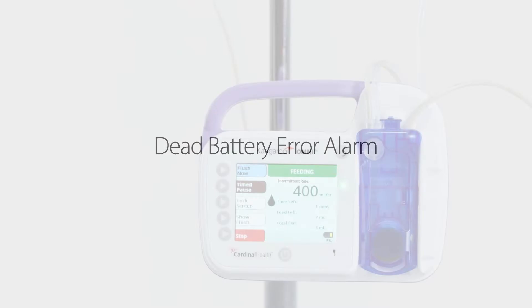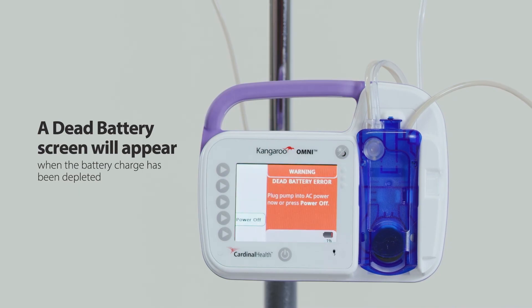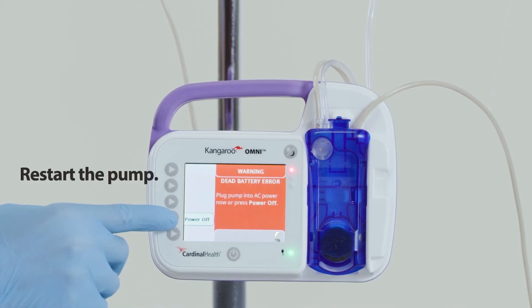Dead battery error alarm: a dead battery screen will appear when the battery charge has been depleted. When this warning occurs, the Kangaroo Omni enteral feeding pump will stop delivering enteral fluids. To resolve the alarm: first, plug the pump into an electrical outlet immediately. Second, restart the pump.